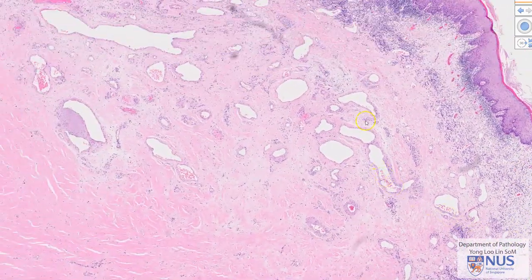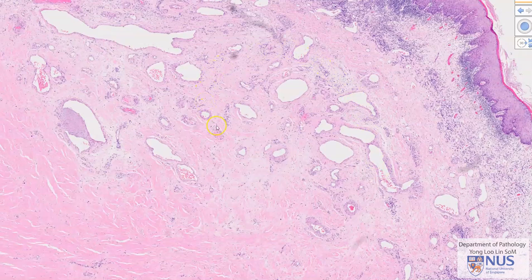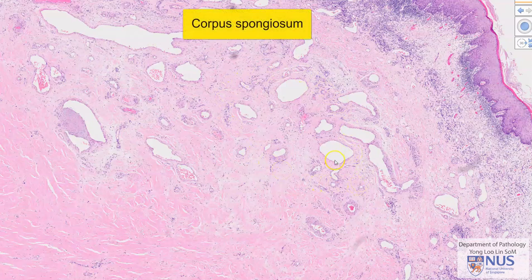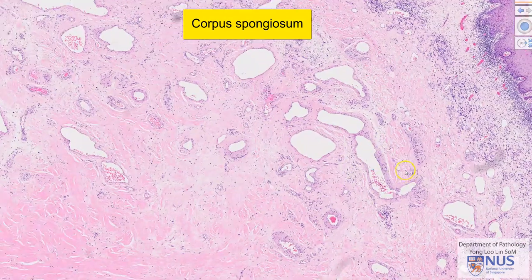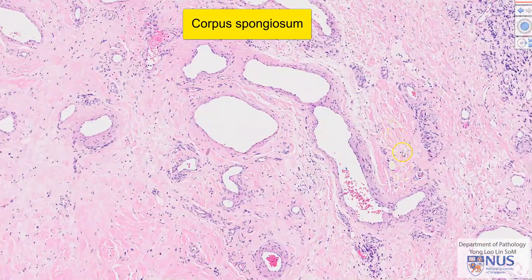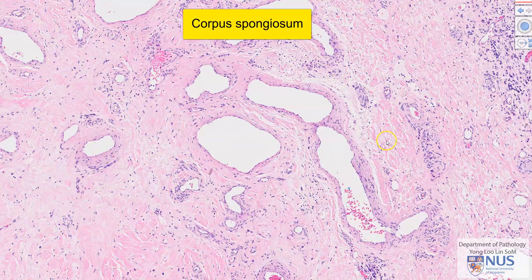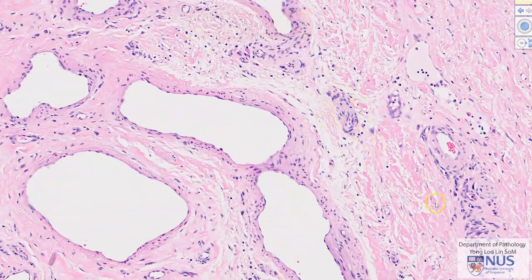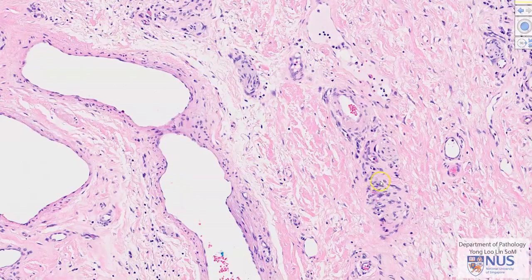Moving deeper, we can see that this area shows lots of large, prominent blood vessels, and this is part of the erectile tissue. This is known as corpus spongiosum, and it is comprised of blood vessels, collagen bundles, and also nerve bundles. We can see a nerve bundle here, and another very small one here.